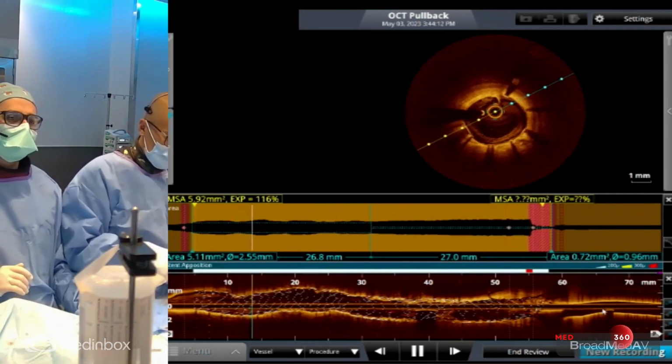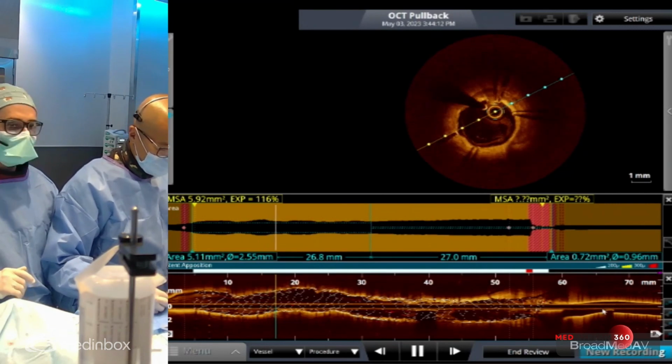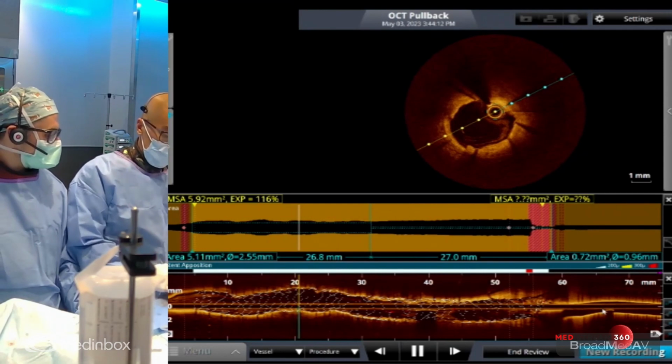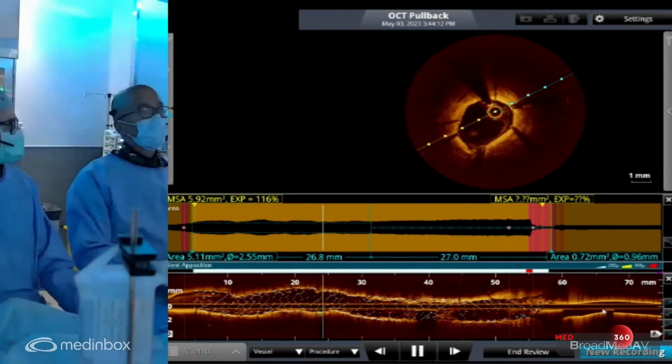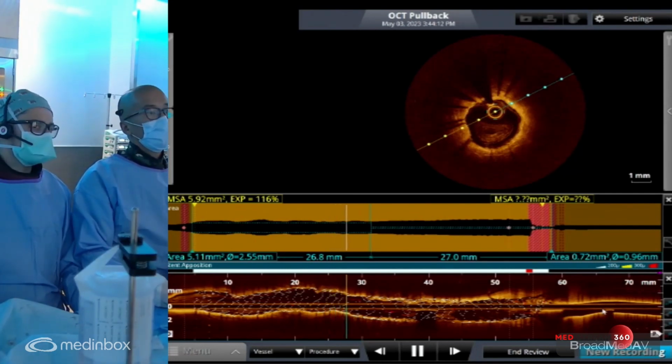For sure. So normally, distal, if everything looks good, we do 2 orthogonal views if we don't use imaging. But if we use OCT, because we already have an angio to minimize that, we can only do 1. And the reason we do 1 is to rule out perforation, because all the other complications can be ruled out on OCT if it was done properly.